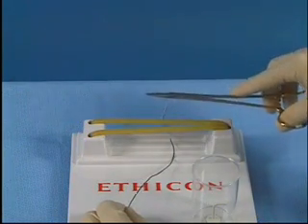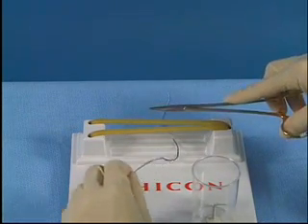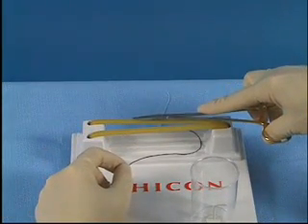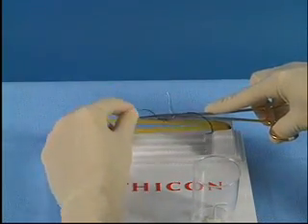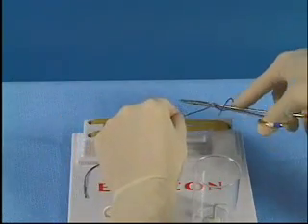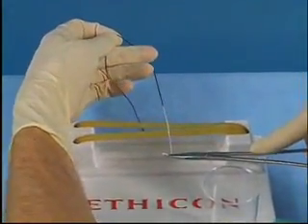A variation that may be used when there is tension on the initial throw is termed the surgeon's knot. A surgeon's throw is done by placing the instrument in the center of the incision between the two strands of suture, as always. The suture is wrapped once and then twice around the end of the needle holder. The other end of the suture strand is grasped and pulled towards the surgeon.